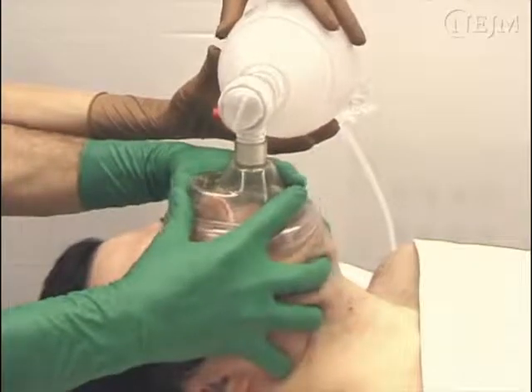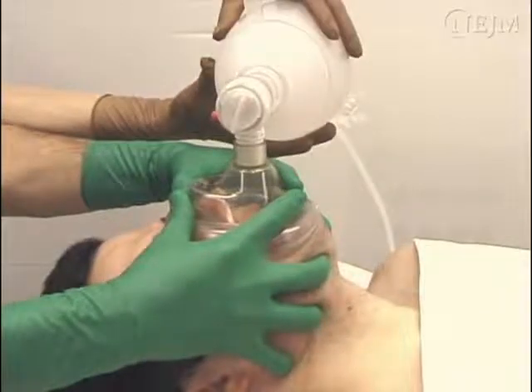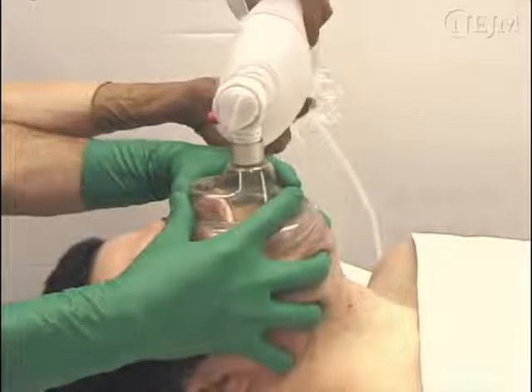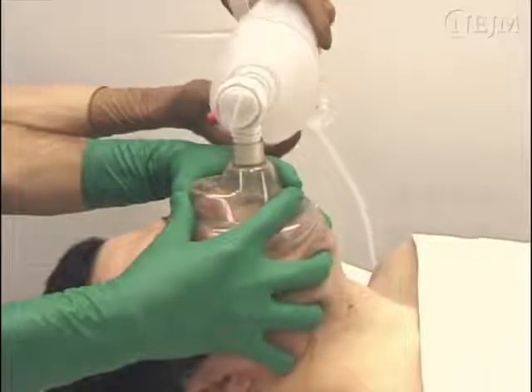In these situations, the mask can be held with two hands, with each hand positioned as described in the one-hand technique. A second person compresses the bag valve device.